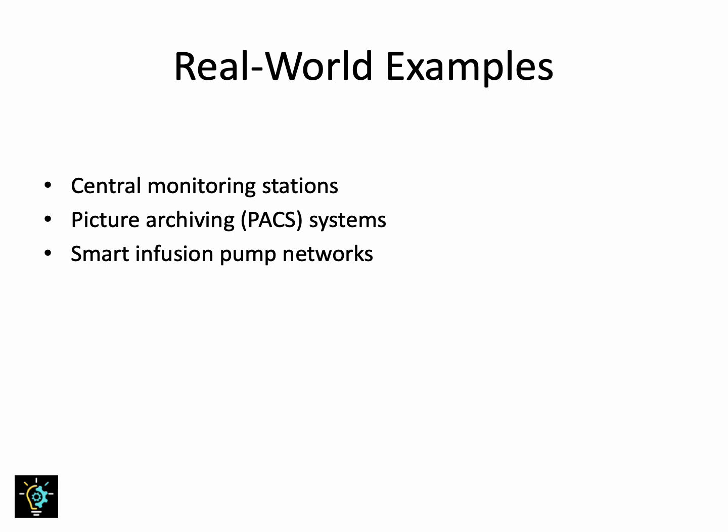Finally, smart infusion pumps often connect to central servers for drug libraries and safety updates. If the network is fragmented, pumps might not receive updates promptly, which could compromise safety. These cases show how geography shapes performance and reliability in day-to-day clinical practice.